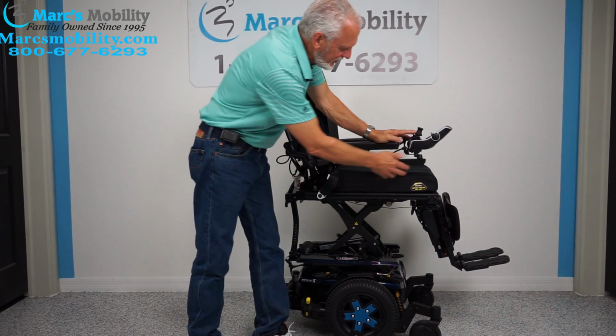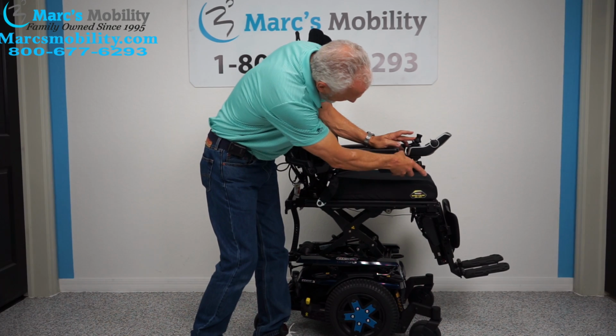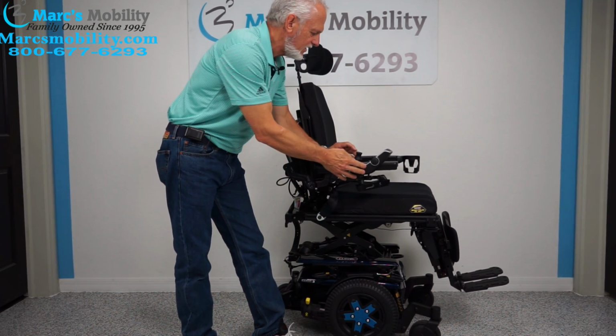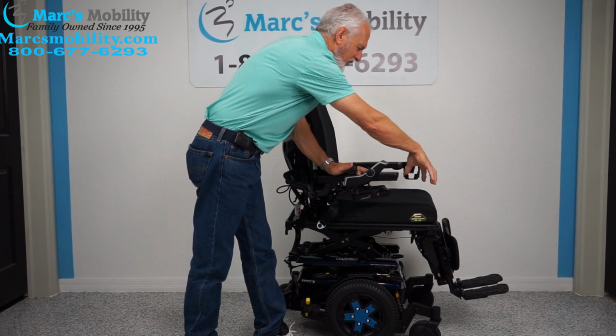As the seat's going down, let's talk about the swing away joystick. There's a swing away joystick right here. What that means is you can bring this joystick from the front to the side.